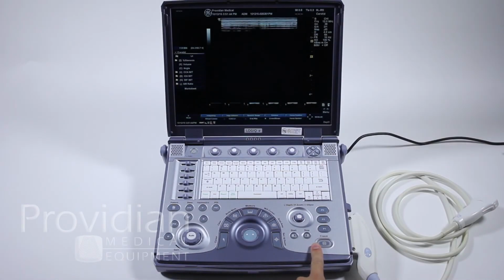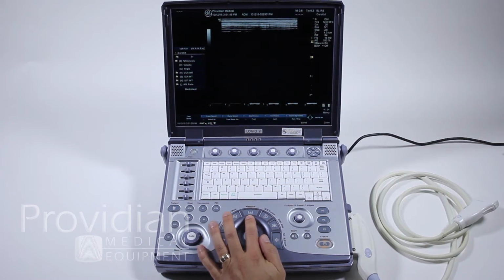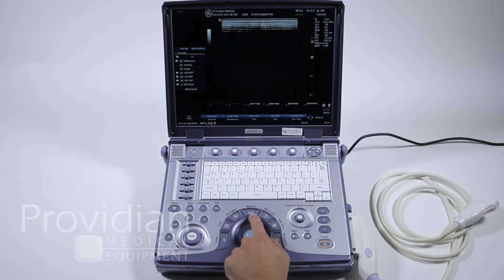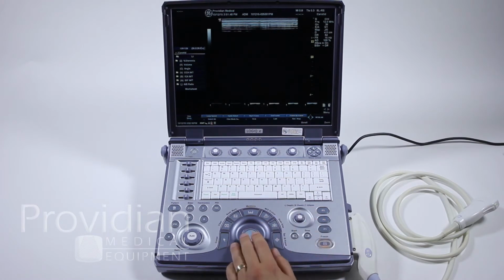To make measurements on the GE Logiq E, press this freeze key. Your next step will be to press the measure key. Measure does both standard distance and basic measurements as well as calculations. The following keys are used in measurements: clear, measure, set, and ellipse. You can also use the trackball.